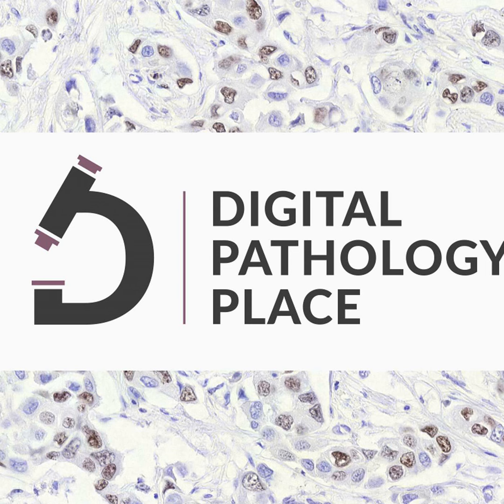So what do we do? We use digital pathology, and there is potential for implementing AI. The group checked the capability of AI to detect nodal metastasis and intranodal nevi in those biopsies.